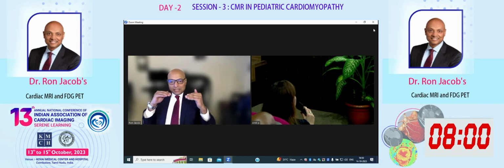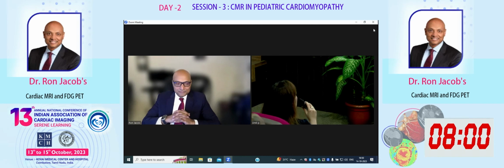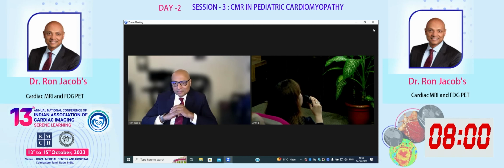So I need a baseline. When you see a baseline, like the patient I showed you, which was really, really bright, sometimes there's a dramatic response in the FDG uptake. Okay, so basically we need to generate more evidence from the CMR point of view, maybe using quantitative mapping, and follow longitudinally over time and see how it compares to PET, and go from there.